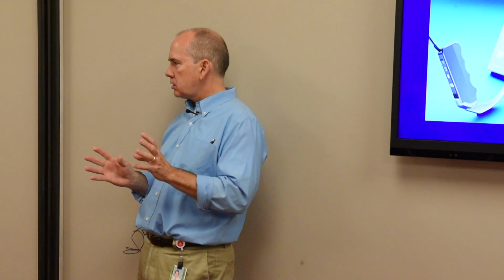So we chose our video laryngoscope because you could be the type. We chose the C-MAC because you can do DL. And so our preference is that the intubator do DL, so they're not looking at the screen. They're doing DL with us. Us as supervisors can look at the screen.